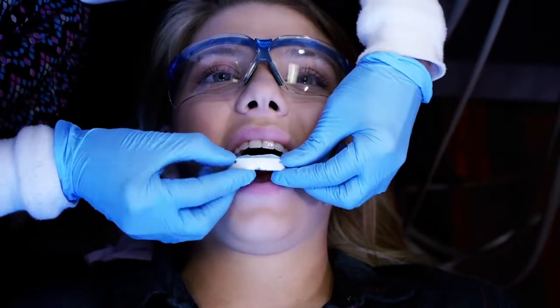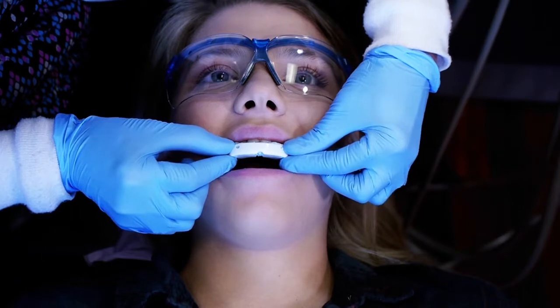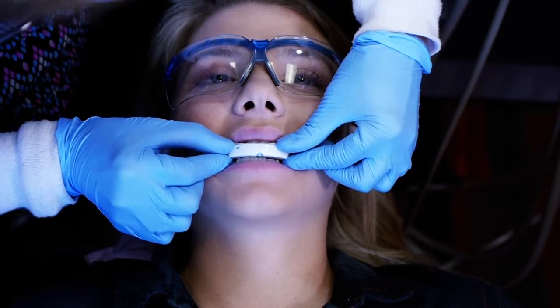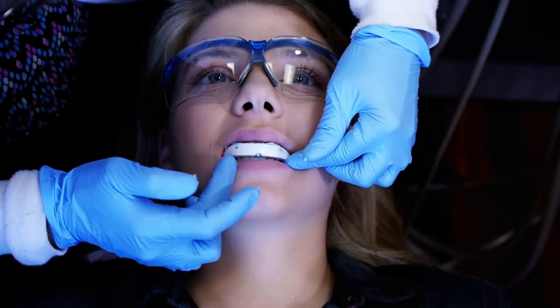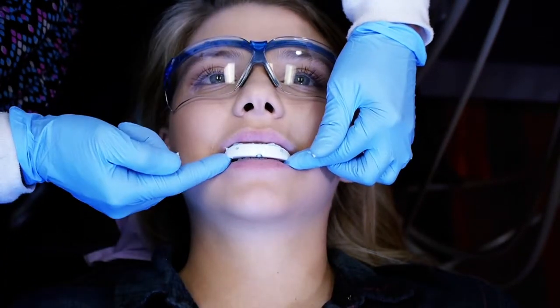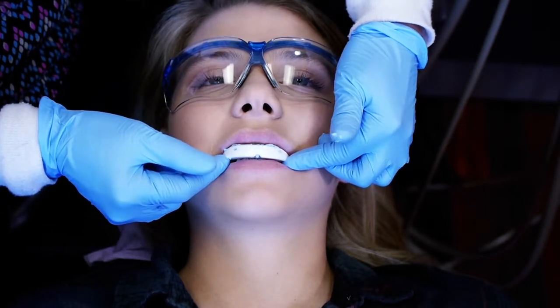I'm going to have Jenna open for me again. I'm lining this up with the midline, positioning the anterior of the flange, and then I'm going to ask Jenna to gently close for me. And again, I'm eyeballing and making sure that I've got a contact on both sides, but that her back teeth are not touching. And now we simply just have to hold it in place until the material sets.